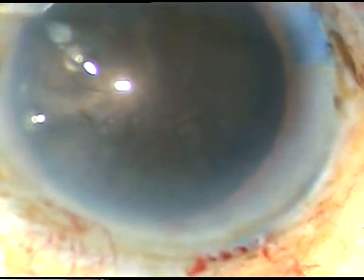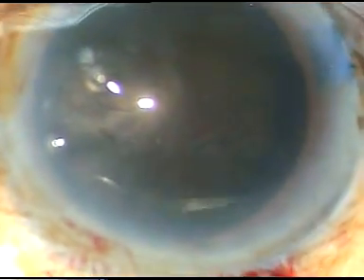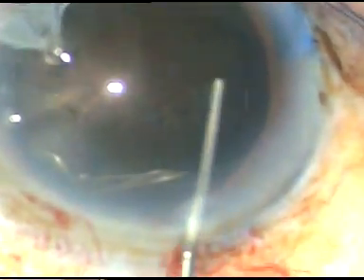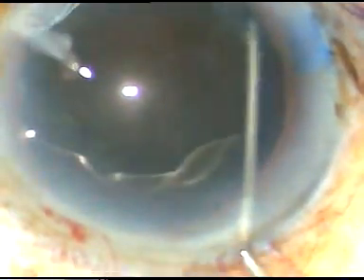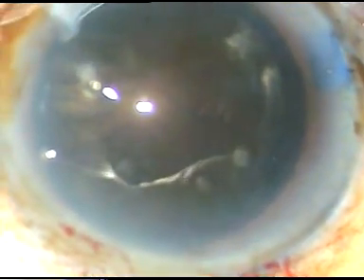This is a large capsulorhexis, about 6 mm — it may be even a little more than 6 mm. Now I am doing hydrodissection very gently. In this case, just hydrodissection at one point could mobilize the cataract, and we can see that the nucleus rotated freely.